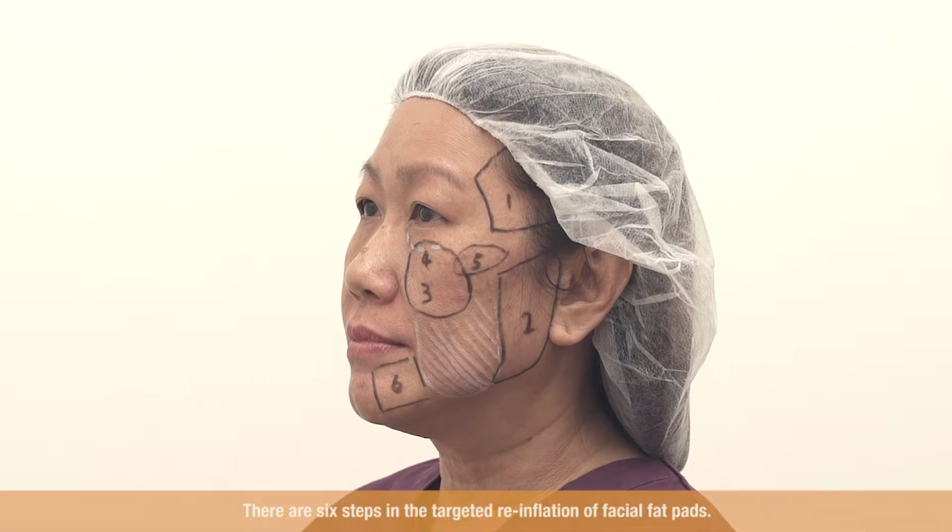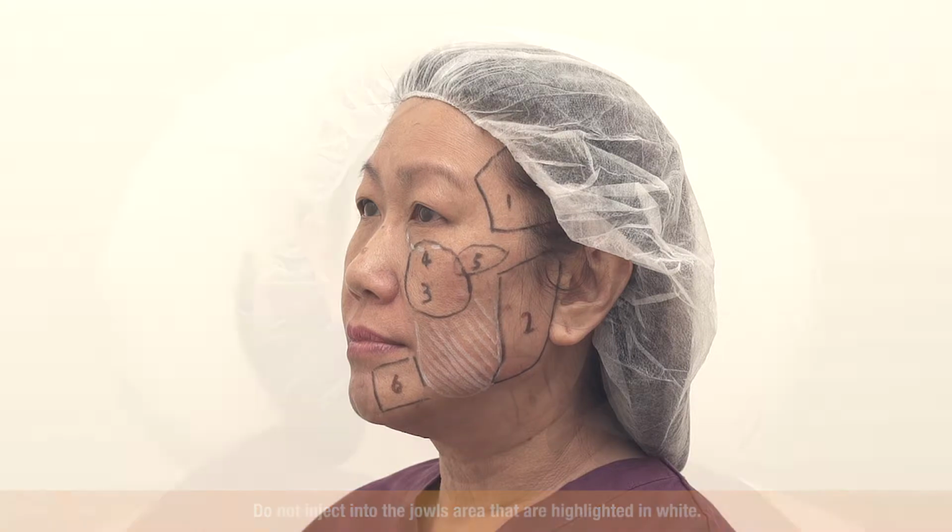The targeted reinflation of facial fat pads can be divided into 6 steps, or 6 regions, in this sequence. The first region is the superficial temporal fat pad. The second is the lateral cheek fat pad, followed by the deep malar fat pad and SOOF. The inferolateral orbital rim and zygomatic arch, or region 5, tend to be affected later in life. Region 5 is the only area that is not a defined fat pad. The last region is the superficial labiomandibular fat compartment. The jowls are highlighted in white and should not be injected.